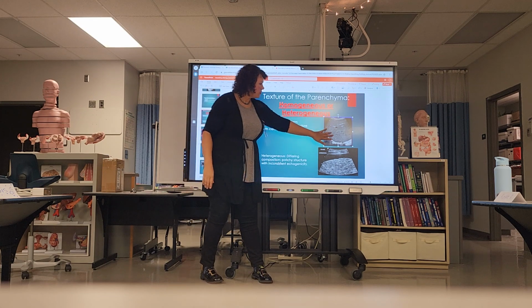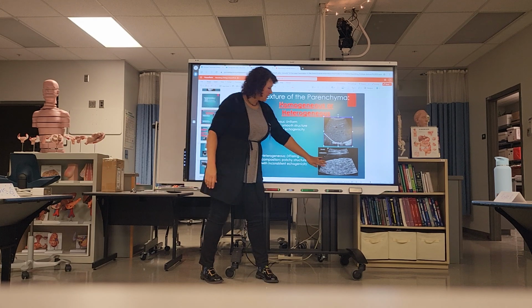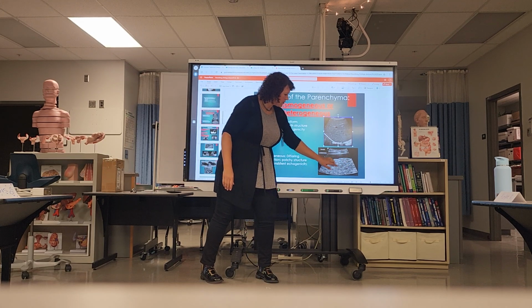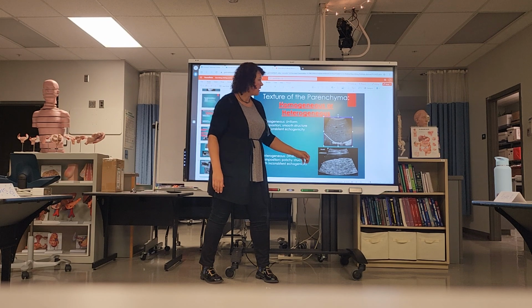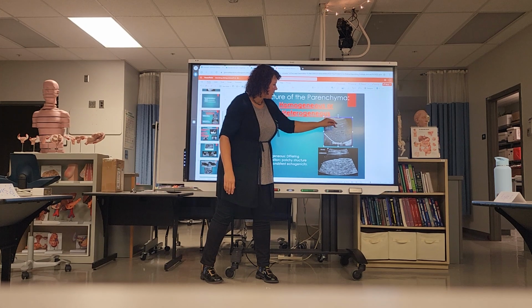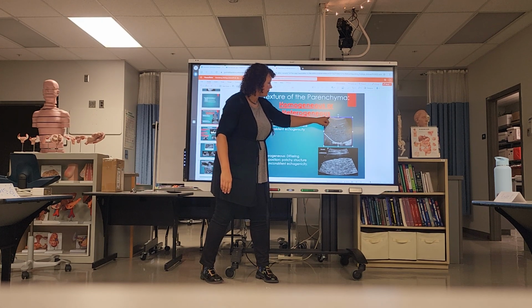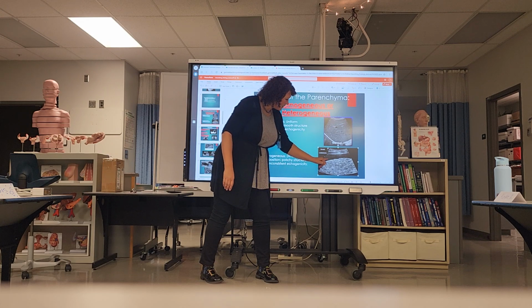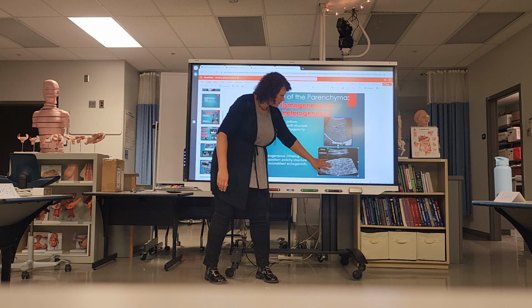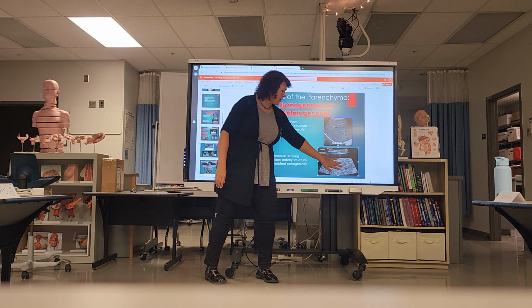So this is a smooth liver parenchyma. Okay. This is a cirrhotic liver. Can you see the difference? Yes. Okay, so when you evaluate the capsule, this is the capsule up here. If you were to zoom in on this, you would have a really smooth capsule. As you can see here, it's not smooth, it's really jagged. And even though this might look like it is all uniform, you'll learn that this is a very heterogeneous liver.